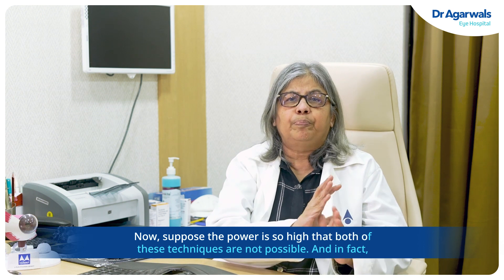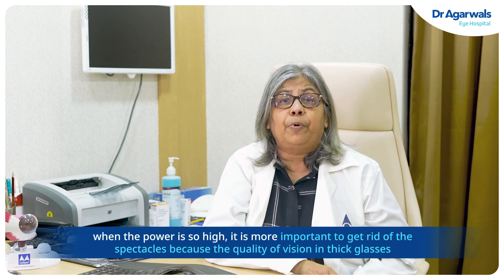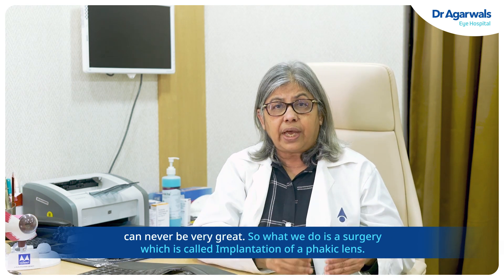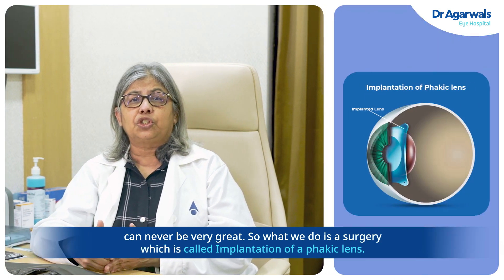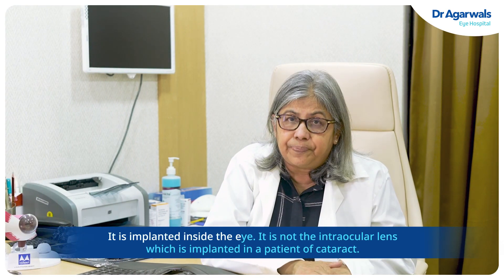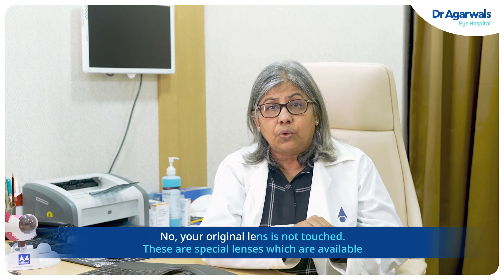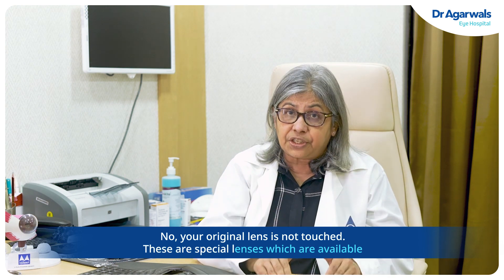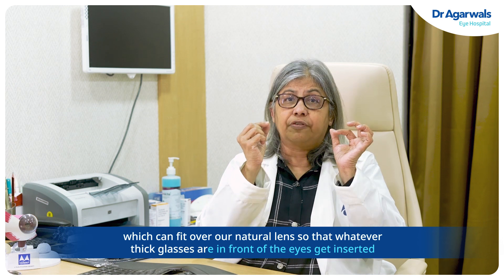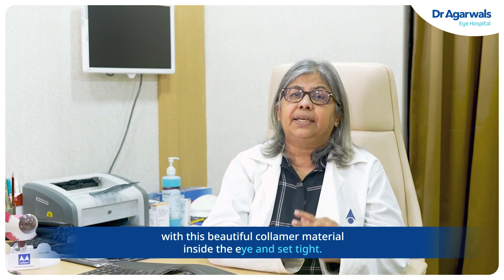Now suppose the power is so high that both these techniques are not possible. When the power is so high, it is even more important to get rid of spectacles, because the quality of vision through thick glasses can never be very great. So then what we do is a surgery called implantation of a phakic lens. It is implanted inside the eye — it is not the intraocular lens implanted in cataract patients. Your original lens is not touched. These are special lenses that can be fitted over your natural lens, so that whatever thick glasses were in front of the eyes are replaced by this beautiful collamer material implanted inside the eye.